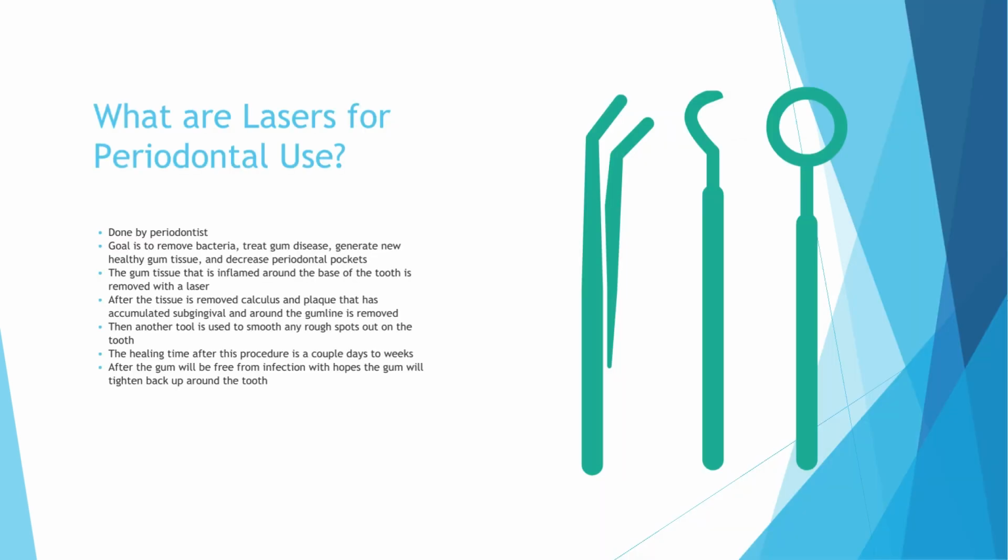So what exactly are lasers for periodontal use? It's done by a periodontist. The goal overall is to remove bacteria, treat gum disease, generate new healthy gum tissue, and decrease periodontal pockets.